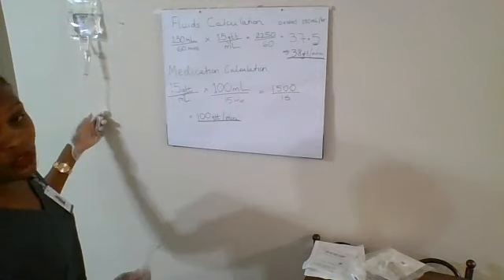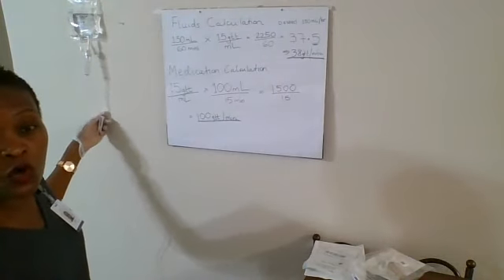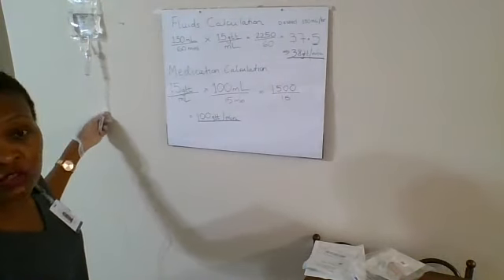I'm going to use my drop factor and count for a whole minute. I want 38 drops a minute.